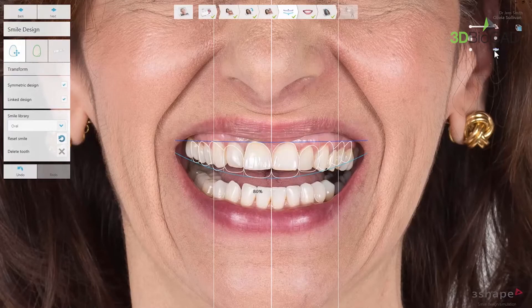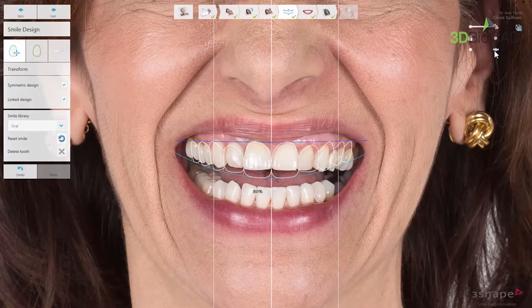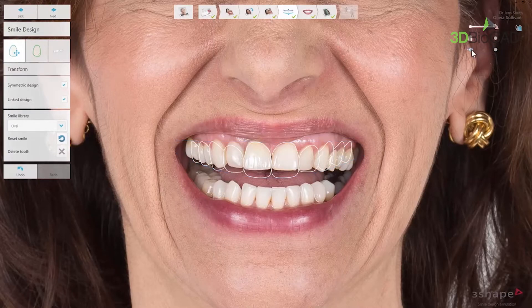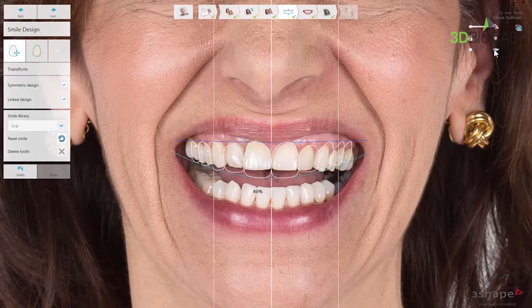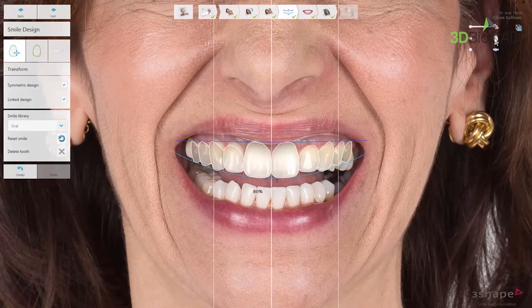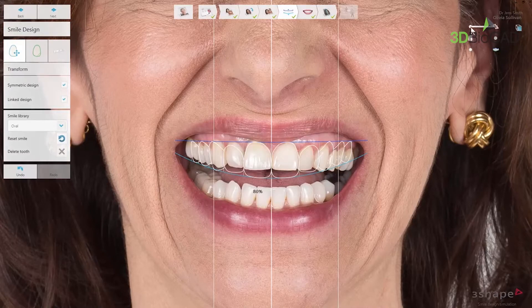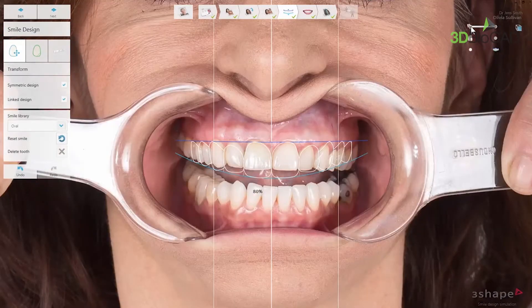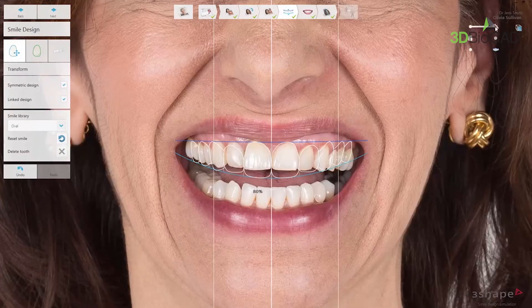The sliders are located in the upper right side of the user interface. Use the sliders or shortcuts visible in brackets while hovering over a given slider to view or hide the smile frame, turn the simulated teeth texture on and off, and switch between the smile and retracted photos if available. To see the full face, click on the front view button.